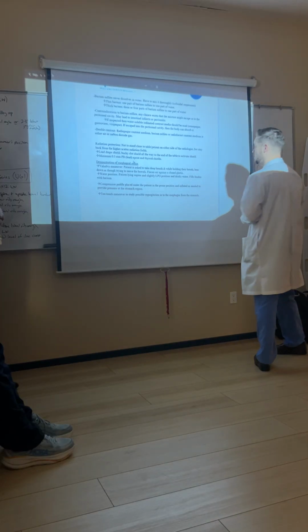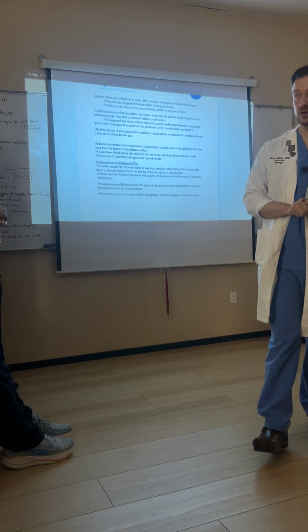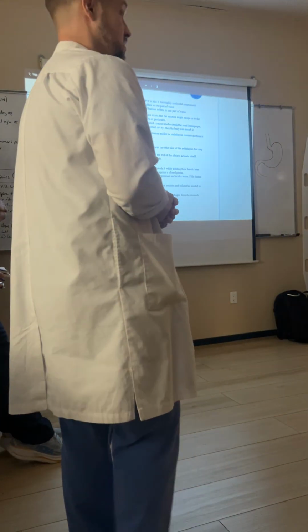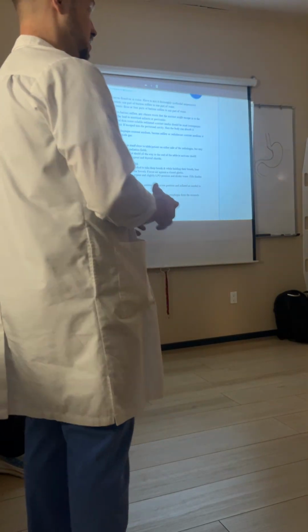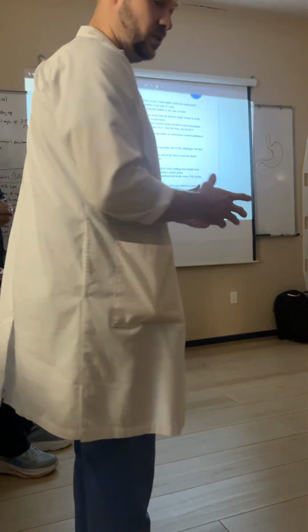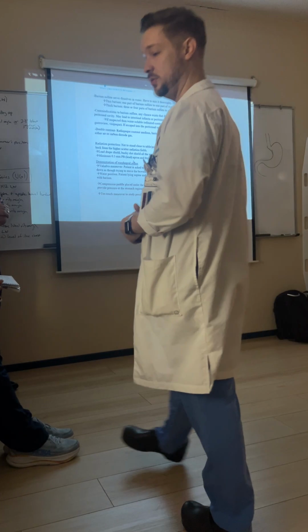Radiation protection. You already know that fluoroscopy is one of the areas of our job where our occupational exposure is the highest, okay? With that said, don't stand right next to the patient the entire time, okay? While you're watching the patient, you can still find opportunities to stand back a little bit, okay? You can still keep an eye on the patient, or you can stand behind the radiologist.